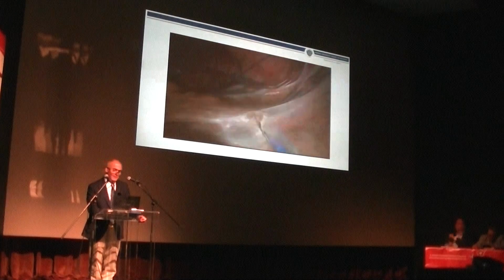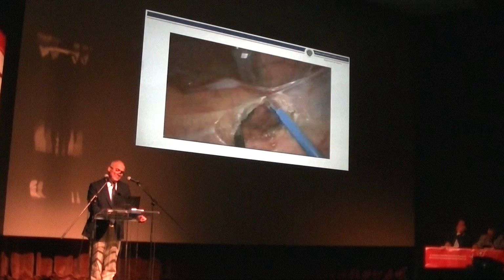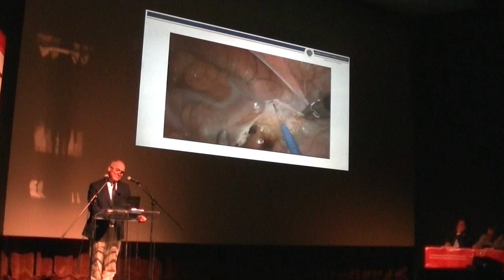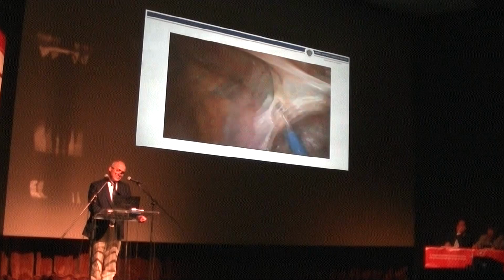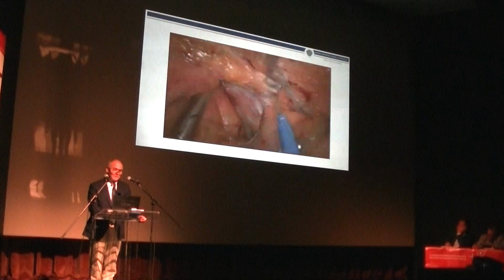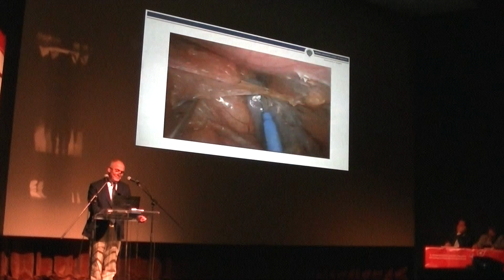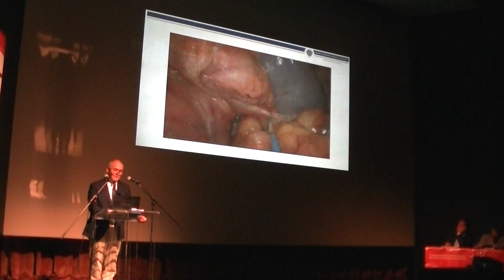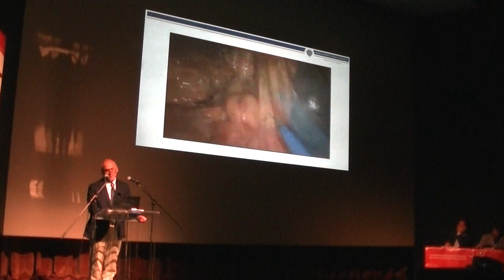And then we start the lateral dissection. And be aware not to damage the spleen. So you're taking down the adhesions, the splenocolic adhesions.